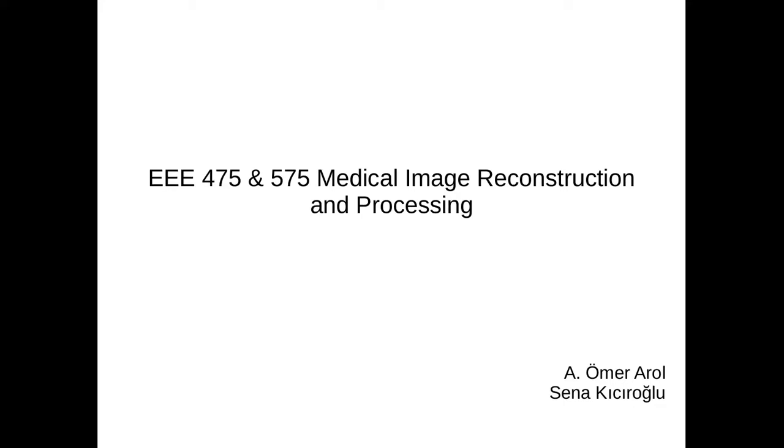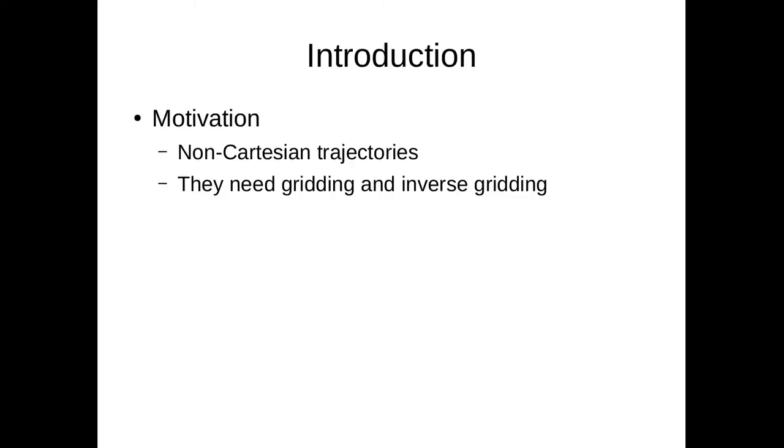Hello, we are Ömer and Sena, and our project is inverse gridding. Inverse gridding is a technique used in many areas of medical imaging. In this project, we have demonstrated inverse gridding for 5 different trajectories and 4 real MRI images.